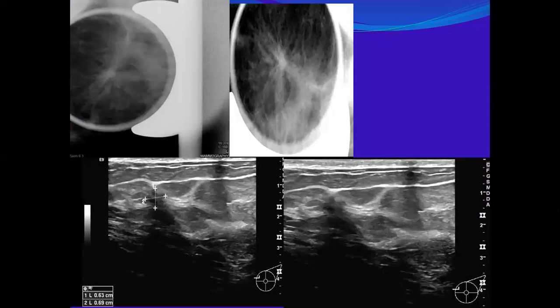I spent more than an hour with her to convince her to do that mammography. You see? And after we finished, I also convinced her to do the spot magnification and to proceed to the ultrasound. And we could appreciate this tiny cancer.